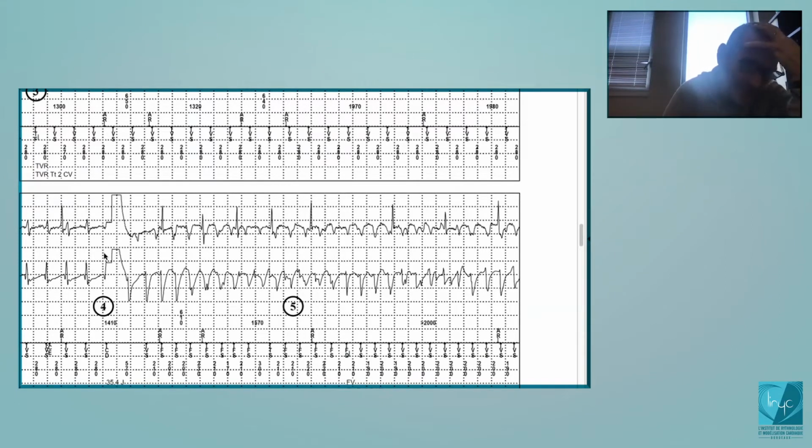So in these patients with high defibrillation threshold, you need to consider first: should we implant this patient or not? Because there is a huge risk of induction of life-threatening arrhythmia. And in this patient, you want to avoid, and that's going to be the subject of today, the problem of inappropriate shock. It's a huge priority in these patients. If there is an inappropriate shock, then there is a high risk of induction of arrhythmia, and then a high risk of non-reduction.